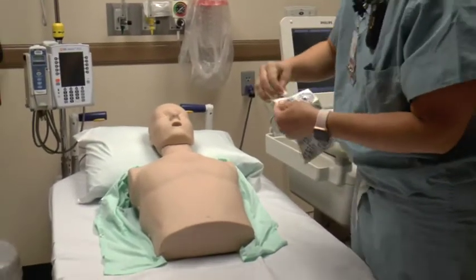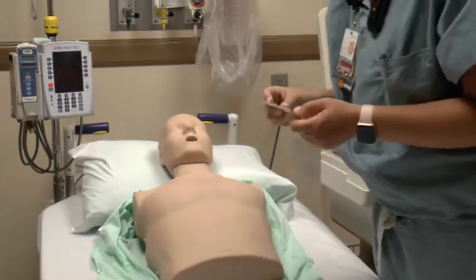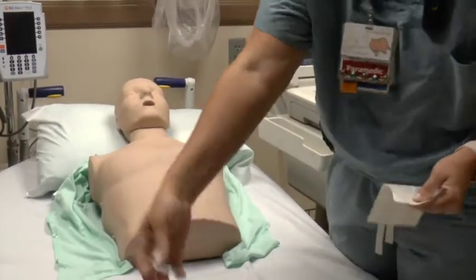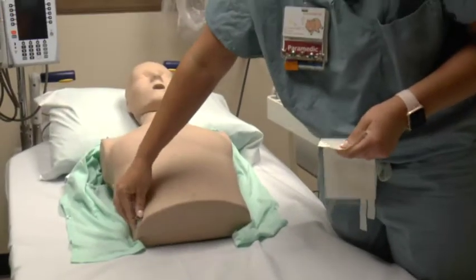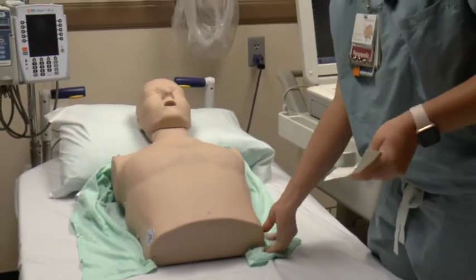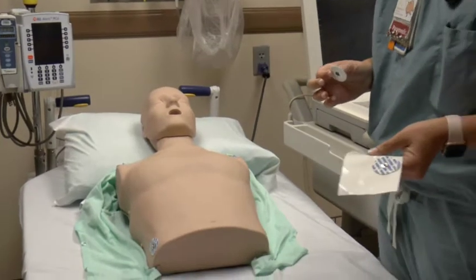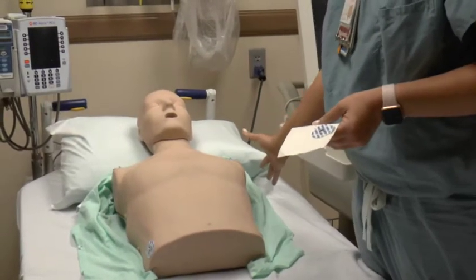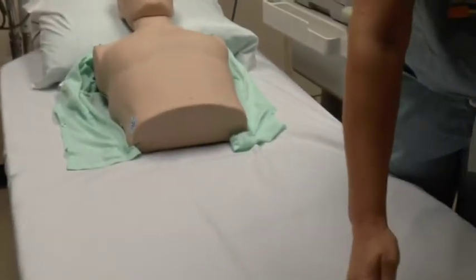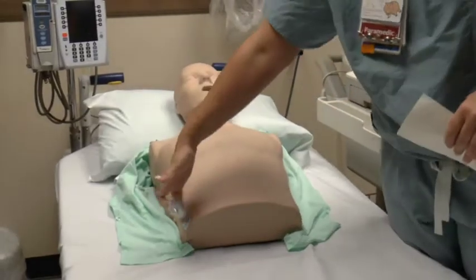One patch goes on the right arm if there's an arm there, one on the left arm, one on the right leg — you can use the lower abdomen since we don't have a leg — and then the same on the left. Ideally you want the limb leads more on the outside of the arms, and on the legs kind of on the inside of the ankle, so since we're on the abdomen, just outside of the abdomen.